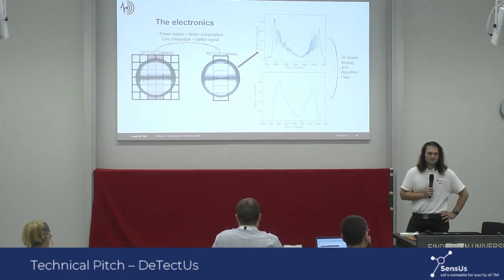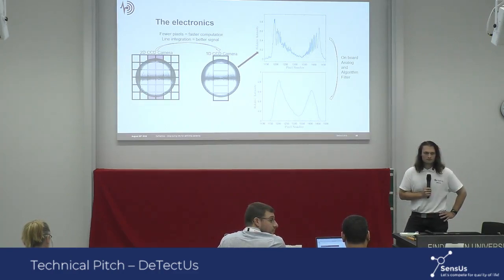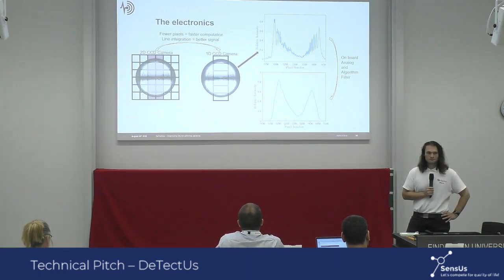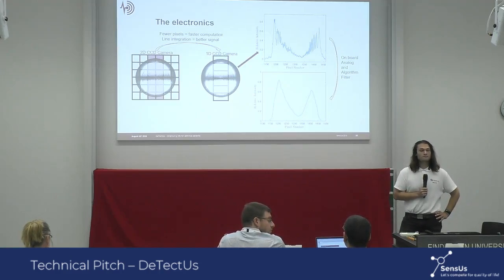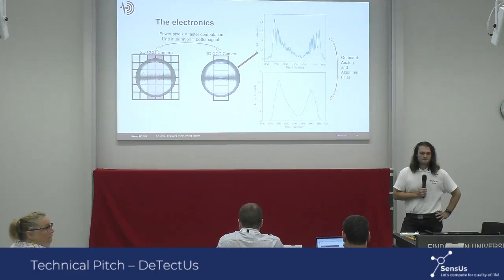Thank you very much. Interesting presentation. What I like is the fact that you don't use a kind of sandwich principle in order to detect adalimumab, in which both branches of the antibody need to be free, because patients can develop antibodies to adalimumab sometimes, in which one of the branches is bound to another antibody. Do you know whether that might affect your signal if you have one of the arms of adalimumab bound to an antibody? Does it matter?